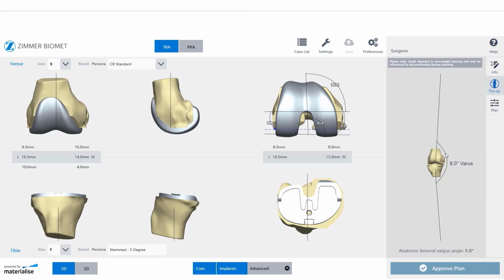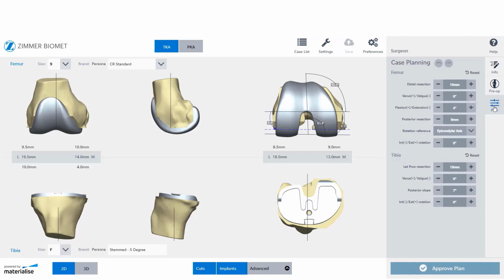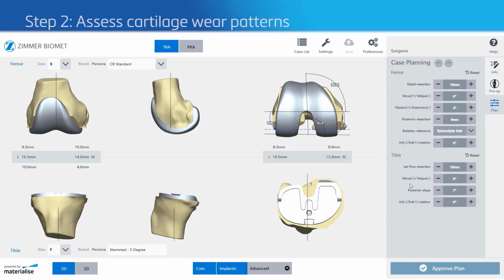As a first step, start reviewing the preoperative varus-valgus angle in the pre-op section. The information about the patient's preoperative HKA angle can be used as input in later steps when fine-tuning the plan for a more personalized alignment.